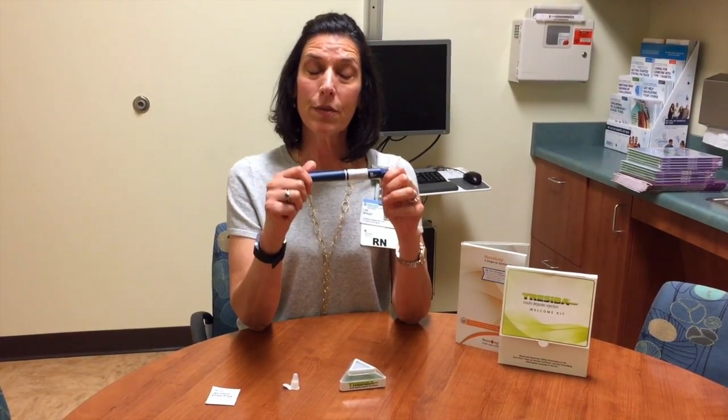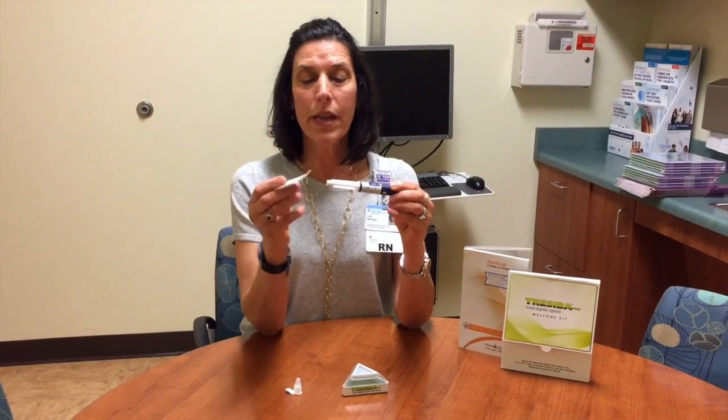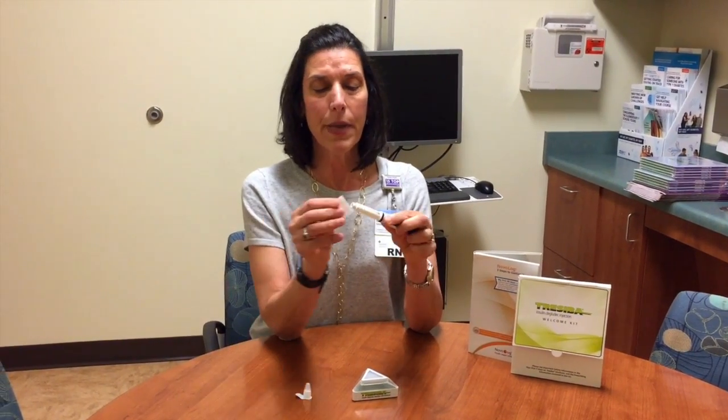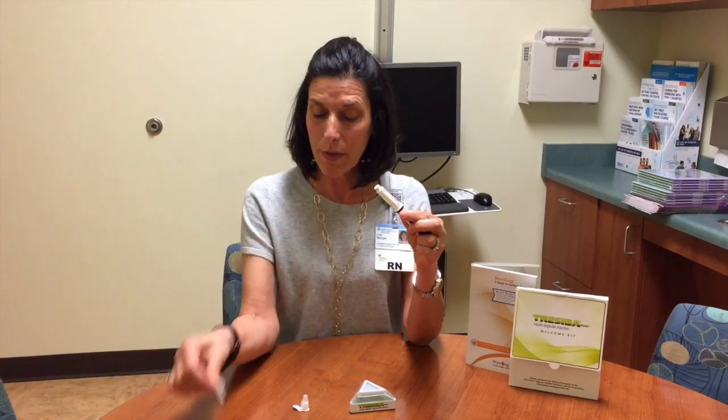So the first thing I want you to do is take the pen cap off, and we are then going to get an alcohol wipe and I want you to wipe the tip of the pen needle off to be as sterile as possible.